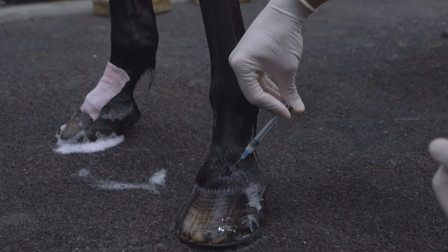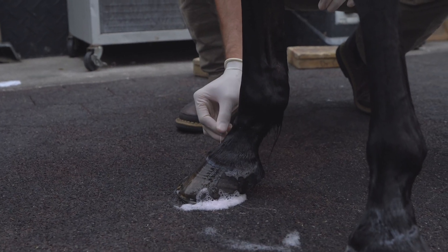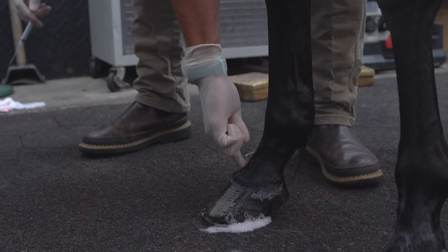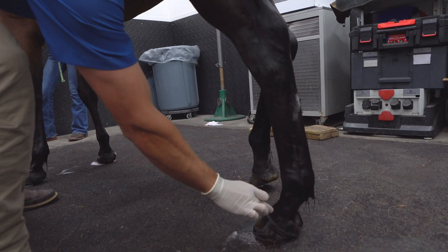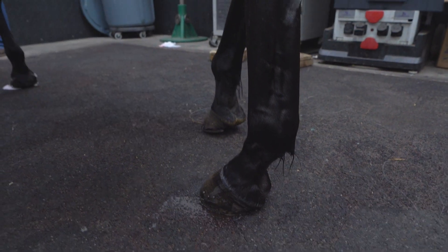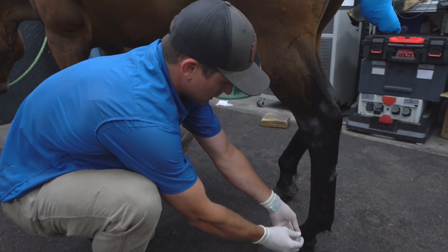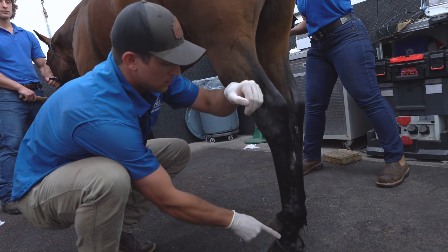Alpha-2 macroglobulin going into that coffin joint — she's gonna love that. This is going into the left hind coffin joint. You can see how much fluid she has — she's pretty darn sore. That's the dorsal joint capsule of the coffin joint. With that negative plantar angle, they get pretty sore, and you can see that joint fluid coming out of there. We're going to put this anti-inflammatory in there and she'll say thank you — maybe not today, but in a couple of days.